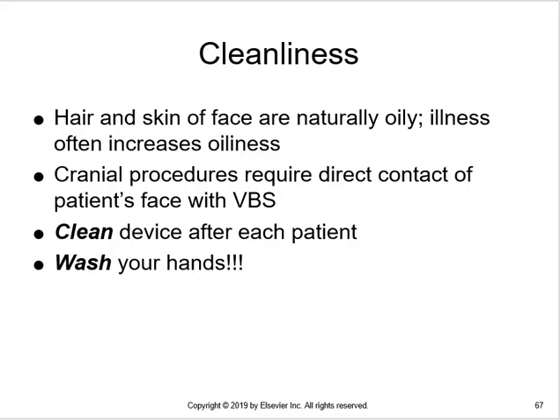So a couple of things. One is that you want whatever you're putting the patient's face or head up against to be clean. So you should be in the habit right now of wiping down your image receptor and your bucky and your tabletop in between every patient. If you're not in that habit, you need to get in that habit. So that's number one. Number two is that even if you wiped it after the last patient, wipe it again, but wipe it in front of this patient.